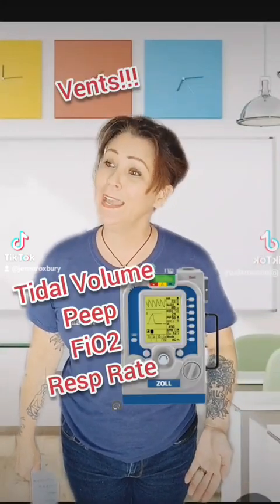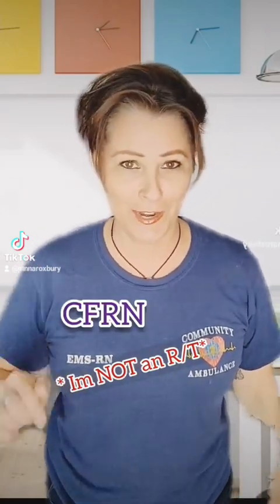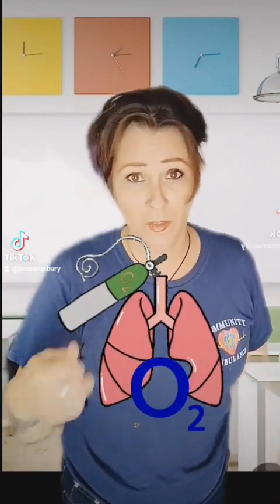Class. Today we are going to talk about vents and how to set them up initially in the pre-hospital setting. Major disclaimer, I am not an RT. I am a critical care transport nurse. So if your patient's lungs aren't working in the pre-hospital setting, it's usually because we've RSI'd them using a sedative and a paralytic. So now we have to breathe for them. Now we have to get the oxygen into their lungs, make it go round and round.